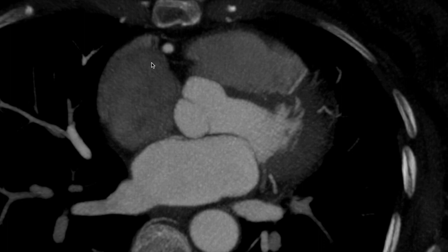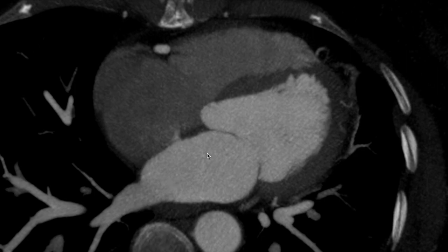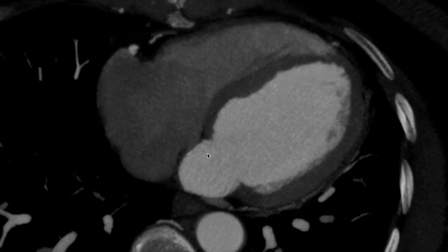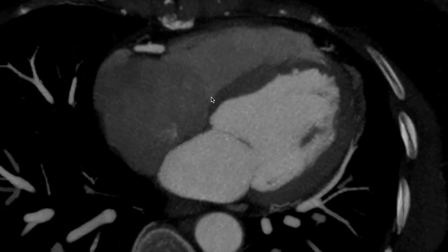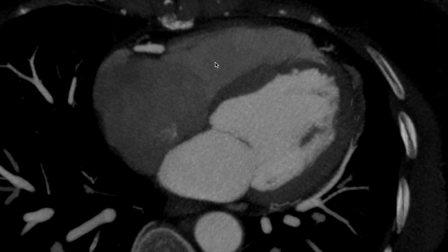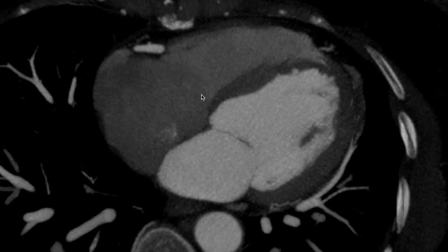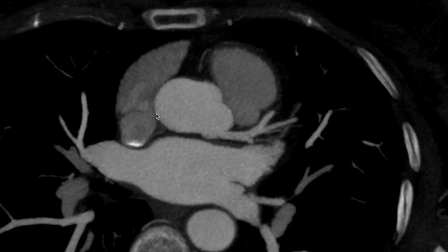Further down this is a four-chamber view wherein we have the right ventricle which is anterior and to the right, the left ventricle which is to the left and posterior, the left atrium, the mitral valve between the left atrium and the left ventricle, the right atrium, and the tricuspid valve between the right atrium and the right ventricle.